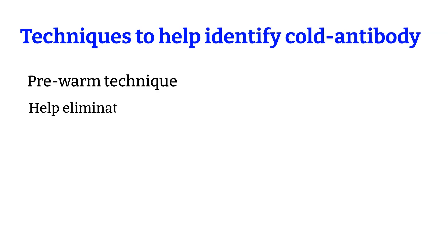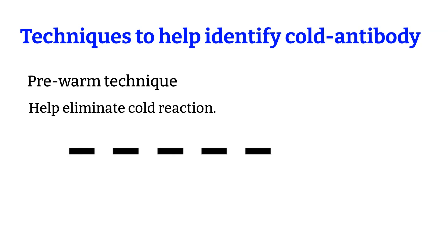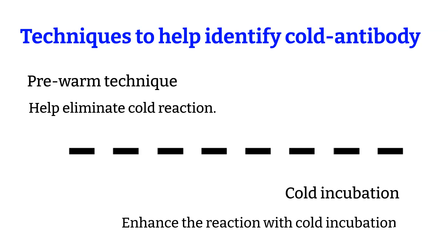The pre-warm technique is your best friend when dealing with cold antibodies — I have a video about it as well. But if you don't want to eliminate the reactions and want to prove your cold antibody theory instead, you can enhance the reactions by incubating your tubes in the refrigerator at 4 degrees Celsius for 15 minutes, spinning them down, and reading the reaction again — it should be stronger. However, if the initial reaction was already 4-plus before cold incubation, then cold incubation won't help.